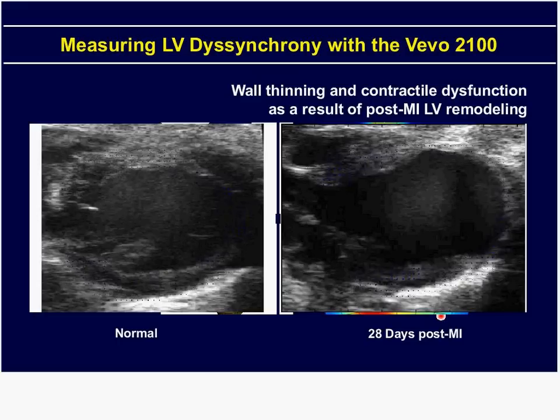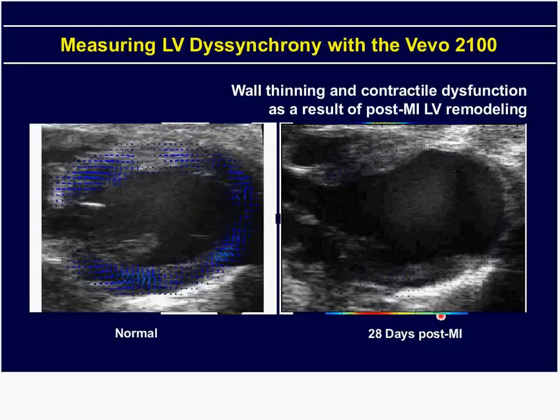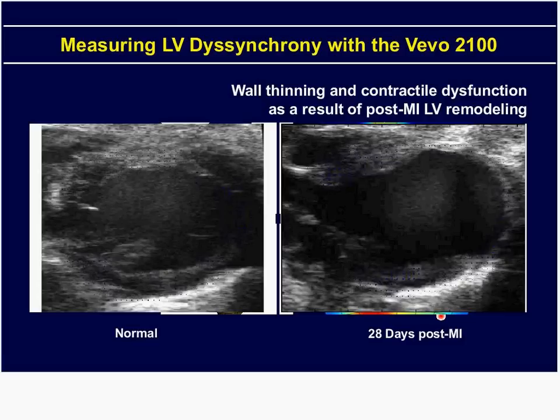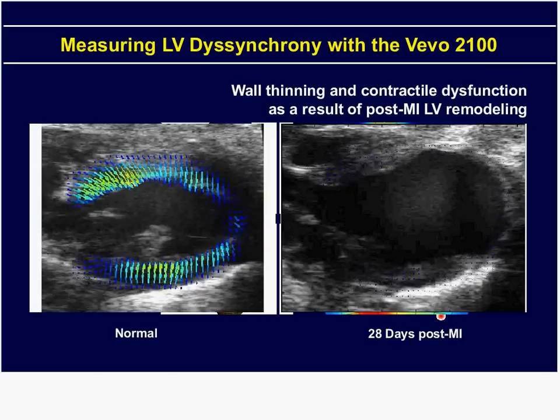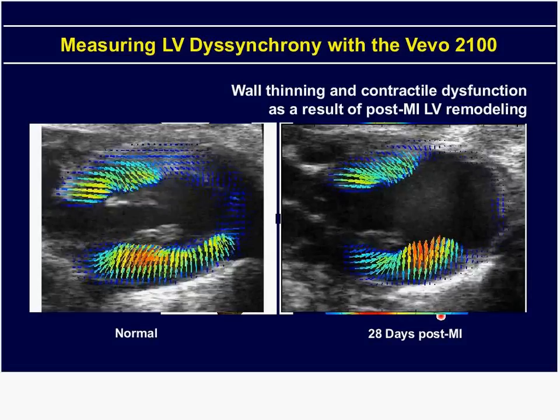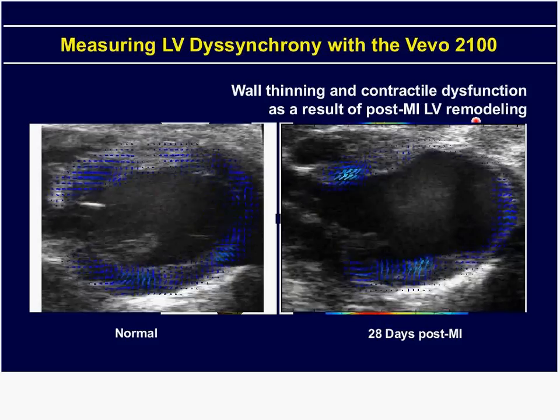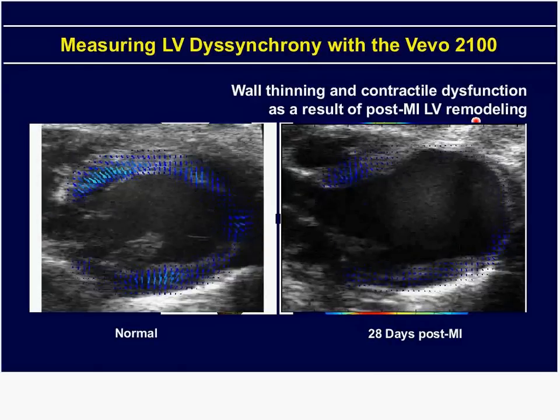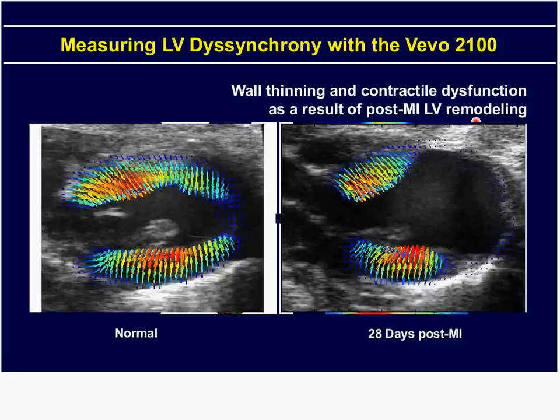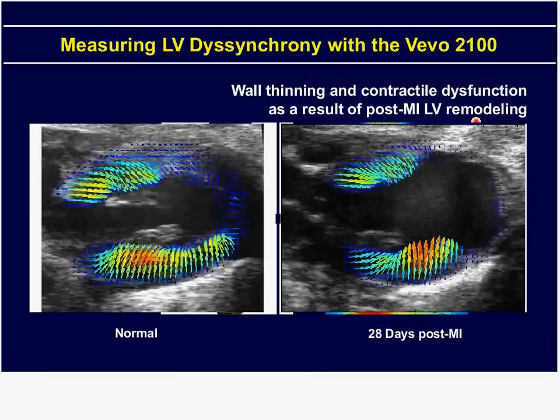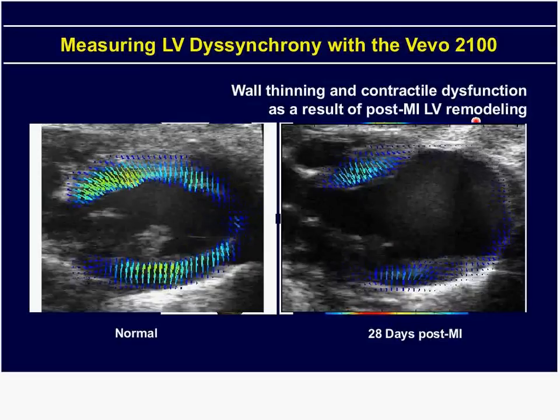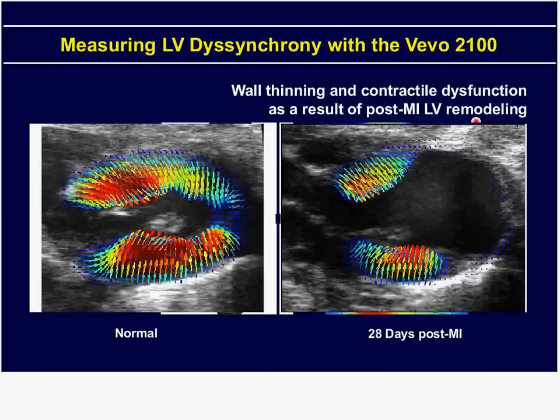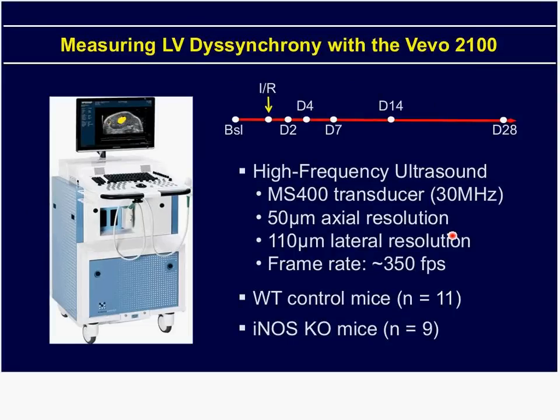We have a couple of additional strain CINEs to show. This is a post-processing analysis to see strain generation throughout the wall throughout the cardiac cycle. Here, 28 days post-MI, I wanted to show this particular CINE because it illustrates the cardiac dyssynchrony that can develop late after MI. Notice that there's almost a peristaltic wave of strain regeneration in the posterior wall, and actually the action is headed in the wrong direction — not very good for cardiac output.